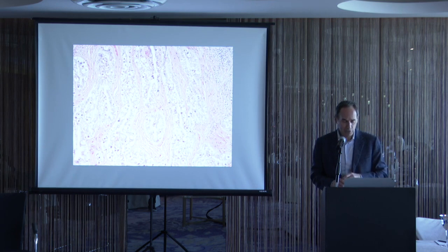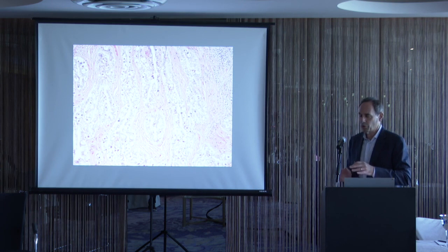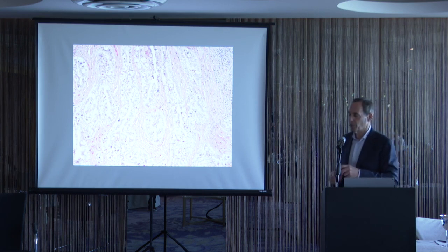Another pattern of seminoma that can be confusing, and I have one of those in the slide seminar, is when seminoma has pagetoid spread into the rete testis. It can be quite extensive, where if one doesn't recognize that these are seminoma cells involving the rete testis, one could mistake these for glands of embryonal carcinoma.